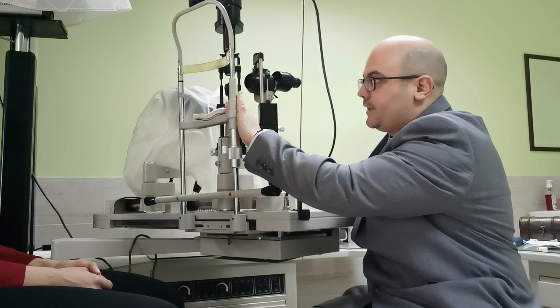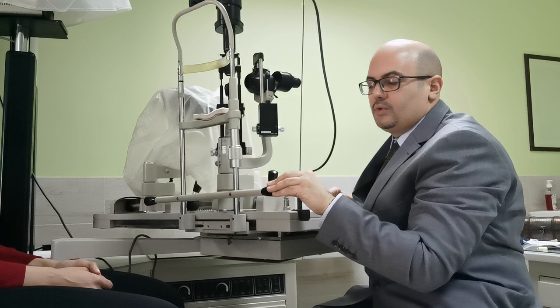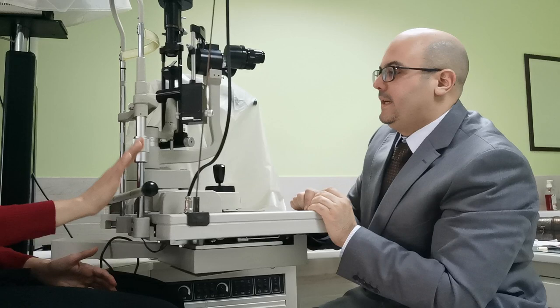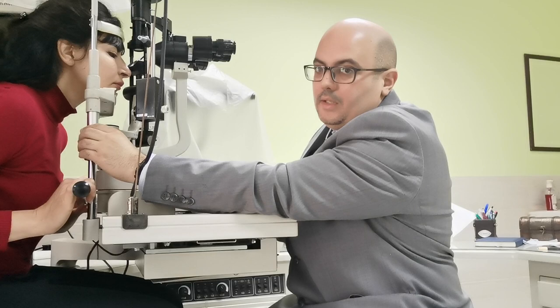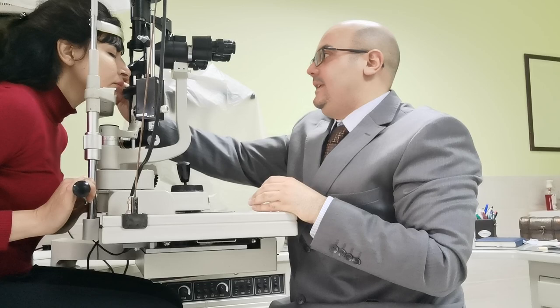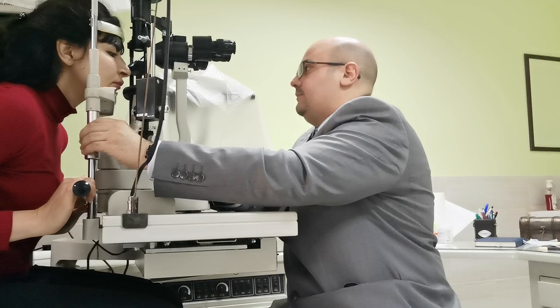You ask the patient to put his chin over here — this is where he puts the chin rest. This is the plastic shell where he places his forehead. This piece is used to keep the patient stable while examining them. It's very important when positioning the patient to put the eye at the black mark at the upper part of the slit lamp bar.